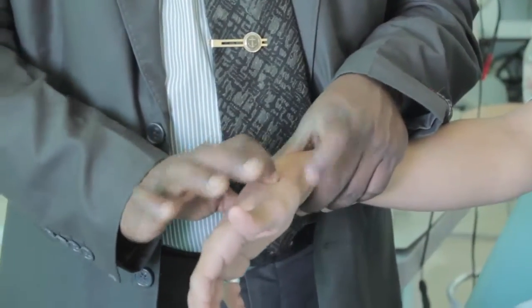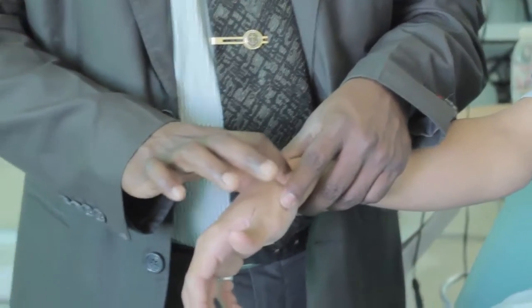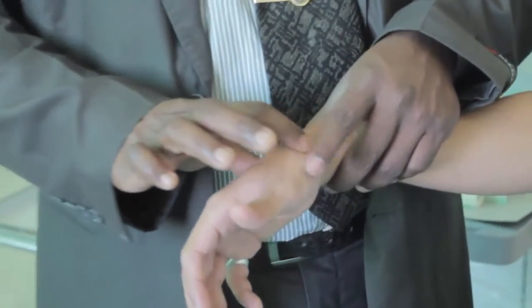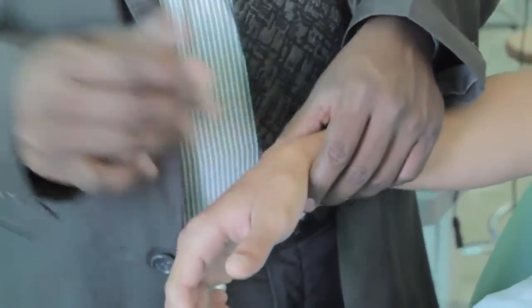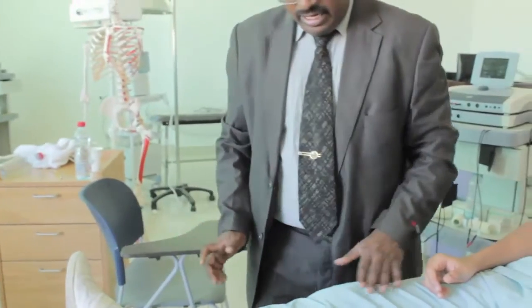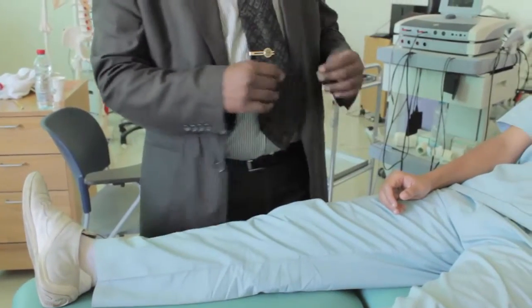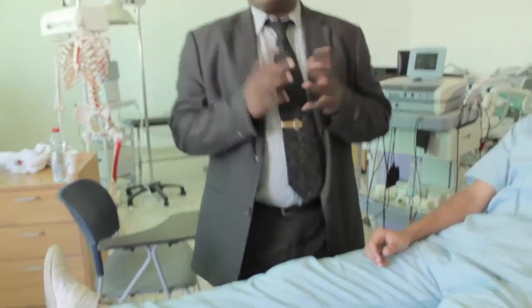It is the anatomical snuff box. In this anatomical snuff box, these two tendons get inflamed, called de Quervain's disease. So whenever there are problems with muscles and tendons because of overuse, they get inflammation, pain. Or there may be swelling, whole hand swelling or whole feet swelling, knee pains, ankle injuries. All of these superficial conditions we can treat with high voltage pulsed galvanic current.